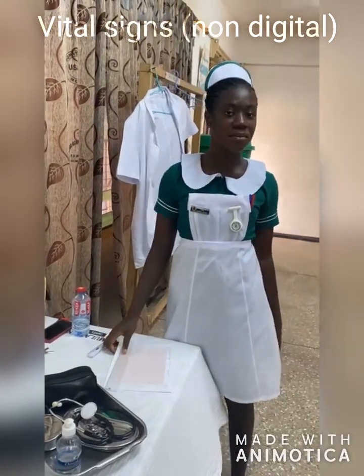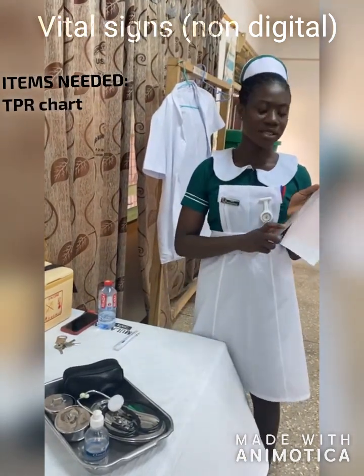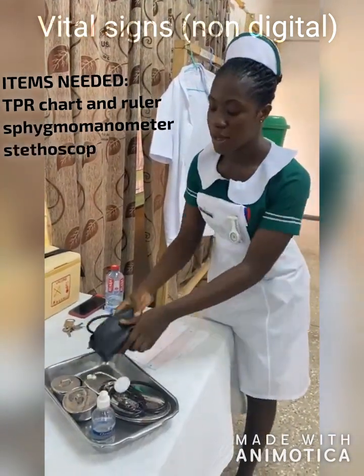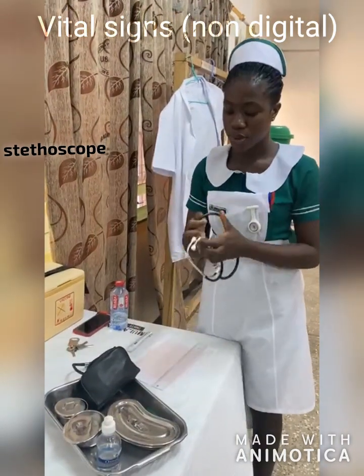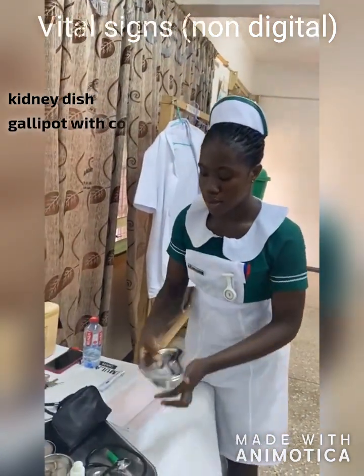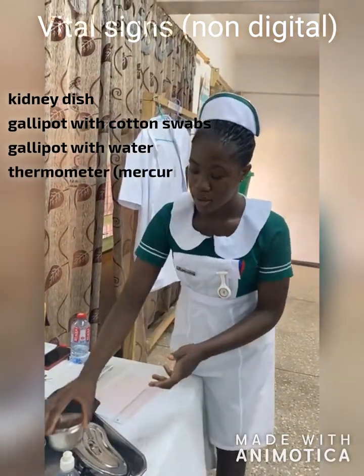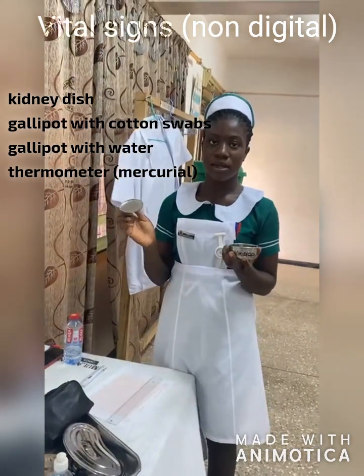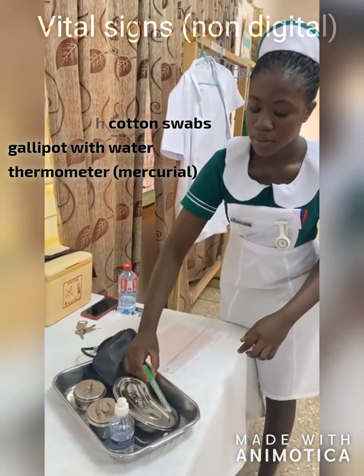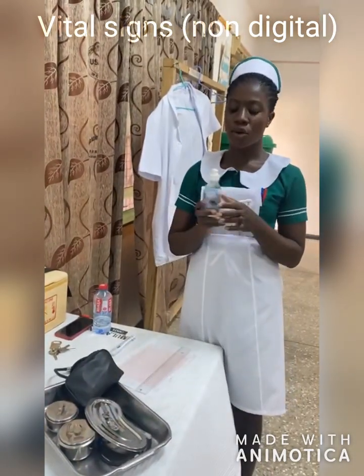vital signs of a patient in bed and the items that will be needed. We need a temperature chart with a ruler, a sphygmomanometer, a stethoscope, a kidney dish for used swabs, cotton in a gallipot, water in a gallipot, a thermometer, and alcohol-based sanitizer.